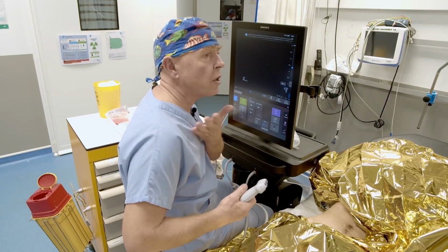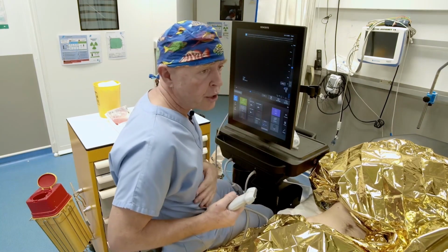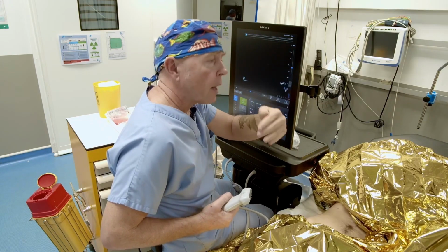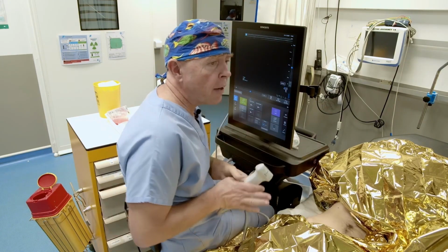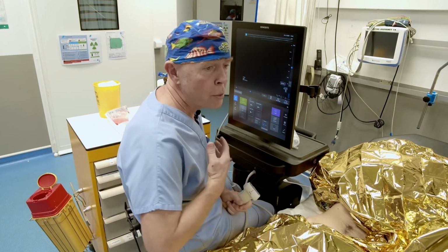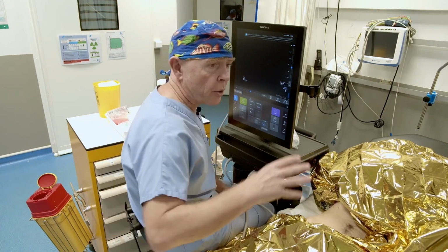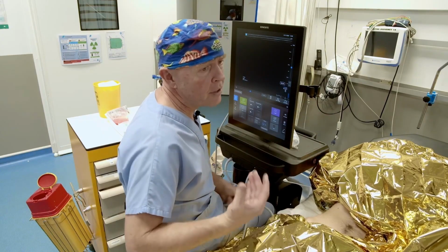Whether it's for thoracic procedures using paravertebral blocks or for colonic and digestive surgery with paravertebral blocks, either unilateral or bilateral. A little bit lower down. So we're going to position ourselves. Actually, I position myself as if I were doing an epidural. I do it with the patient sitting because I am more comfortable, but you can absolutely do them with the patient lying on their side in the lateral decubitus position. Personally, I'm more comfortable with the patient sitting.